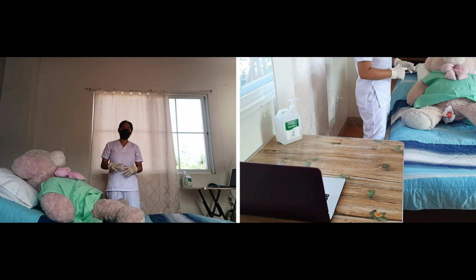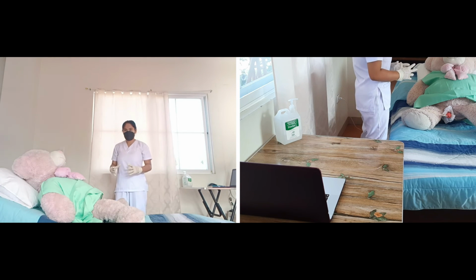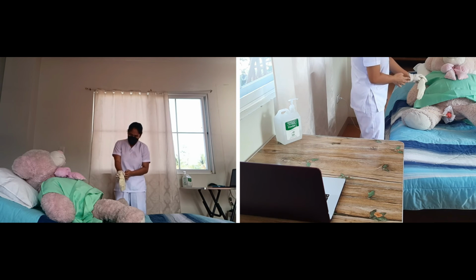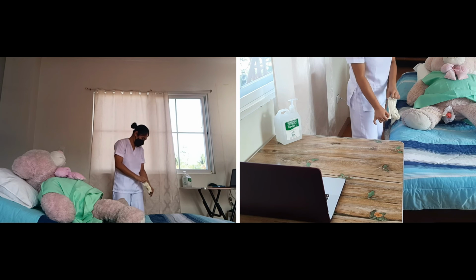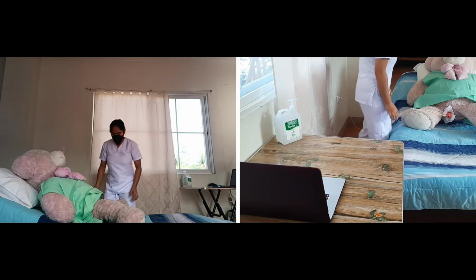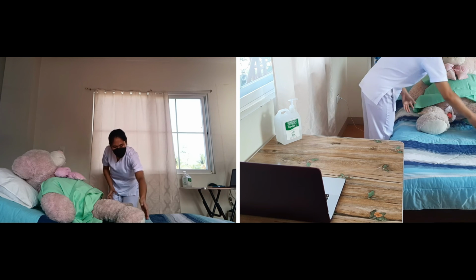So I'm gonna be removing my gloves and assist the patient in a comfortable position again. So Mr. Park, let me assist you.